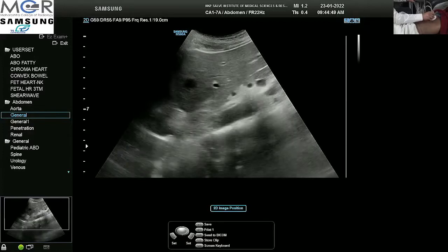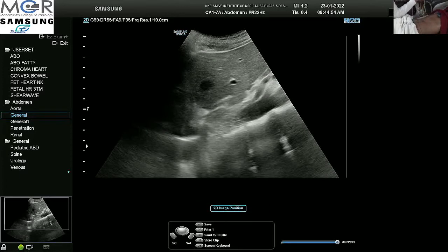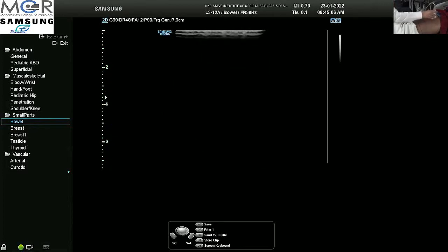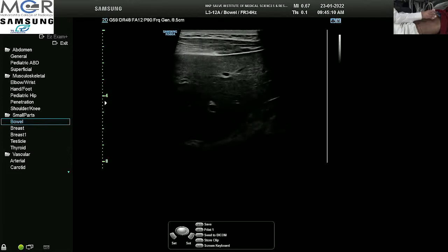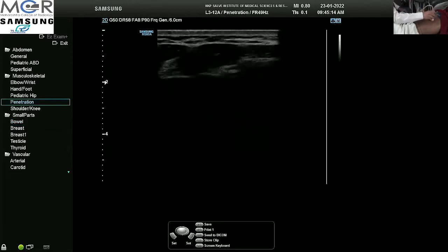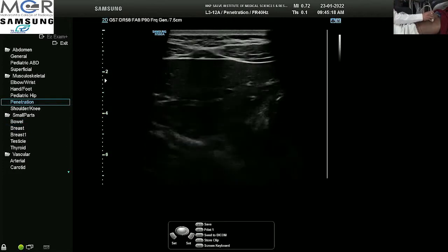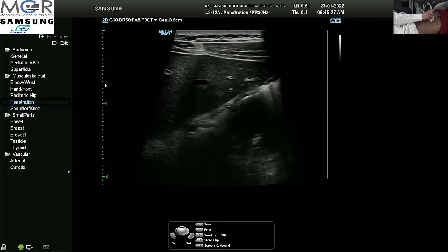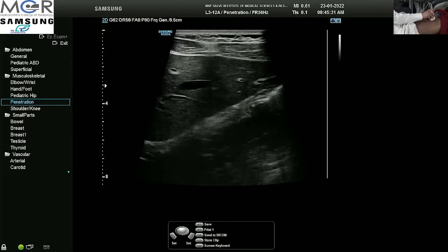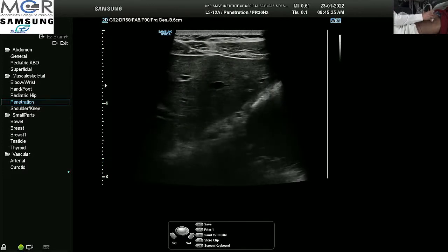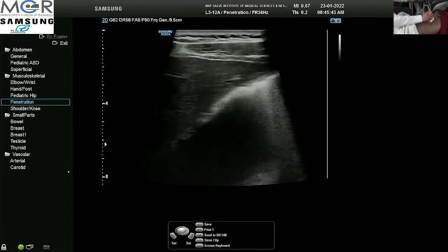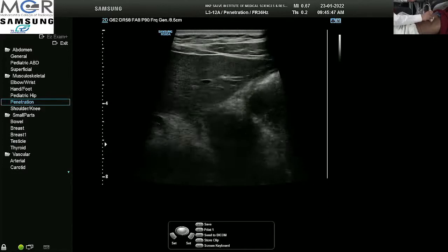Let us try to see the gastroesophageal junction with the linear probe. I am trying to reduce the depth — no, it is not possible. So I will directly go for the stomach. From the epigastrium, we are able to see the mid body and the antrum of the stomach. I have given this patient around a litre of water to drink before the start of this examination. From the epigastrium, we will be able to see only the mid body, the antrum, and the pylorus.